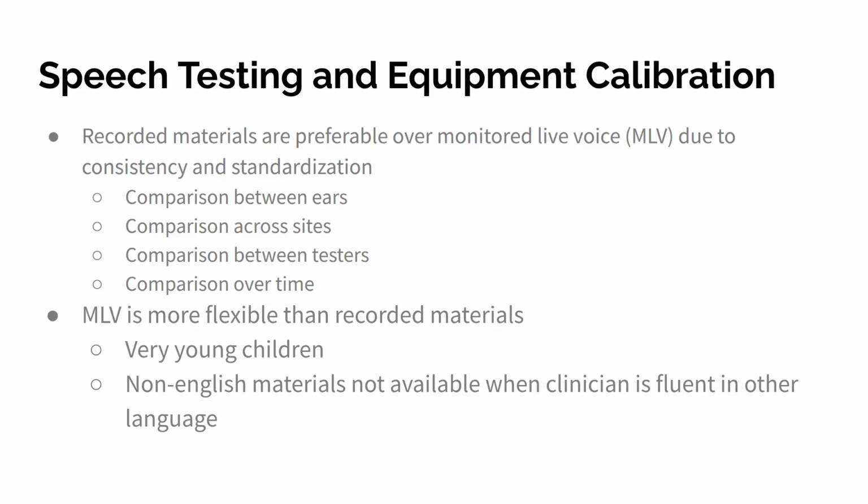There are other benefits to monitored live voice. We can also perform audio-visual perception testing if you want to give visual cues to the patient. There are recordings that are audio-visual, but most recordings are audio only. There are a very limited number of audio-visual recordings.